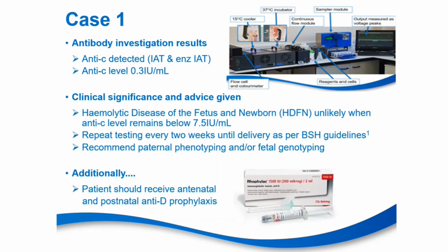Okay, so we've got all our initial test results for this patient. Our antibody investigation results showed that there was an anti-little c detected by IAT and enzyme IAT. And this anti-little c went on the antibody quantification platform, and this was quantified at 0.3 international units. I've put a picture there of the very complicated rapid flow analyzer that we use for antibody quantification.